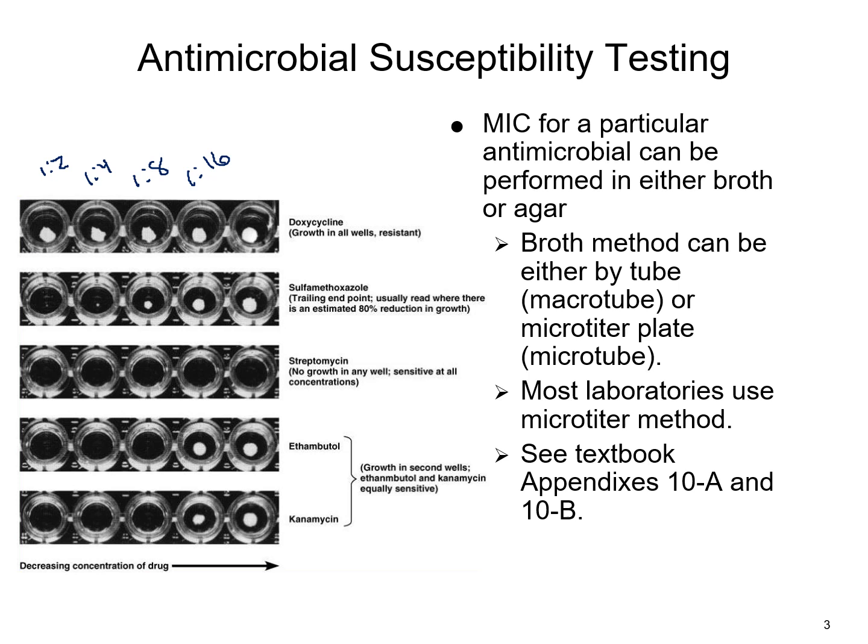You can see in this first well that you actually have growth. This organism is still growing. It grows in every well, which means it's resistant. And then in this particular one, you can start to see some growth here. You can see that little dot, and then you can see it getting a little bit bigger. There's more growth. The less antibiotic in this solution, the more it's able to grow.